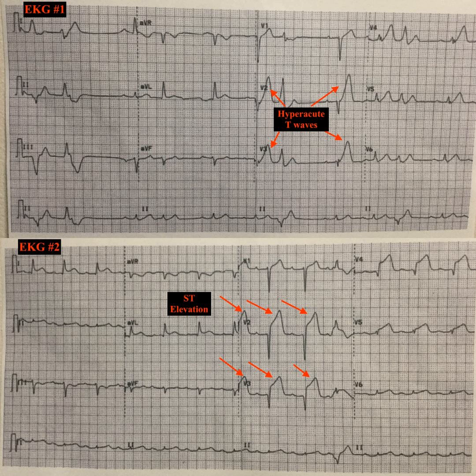So hopefully this gives you a little bit of perspective on this EKG as being a real harbinger for a STEMI. And then you have a little bit of perspective on the evolution of the EKG in an ST elevation MI, both in terms of the hyperacute T waves and then the evolution of the ST segments and Q waves. So this patient goes straight to the cath lab?